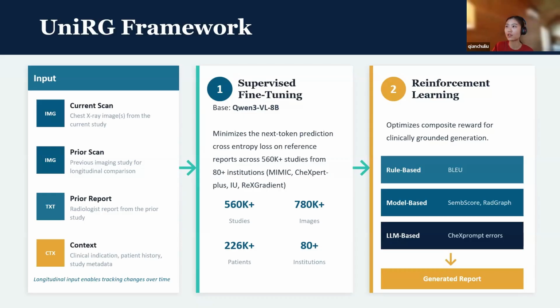But the SFT stage is like a bootstrapping stage where we are already guiding the model a little bit, to have a good base for the search that will happen in the reinforcement learning stage. So the SFT stage is pretty important, especially for a task like radiology report generation, because you still want the model to learn some of the generic patterns from the training data, so that we can optimize from a better starting point. So that is one key finding.